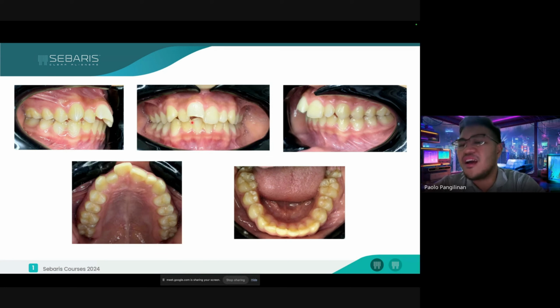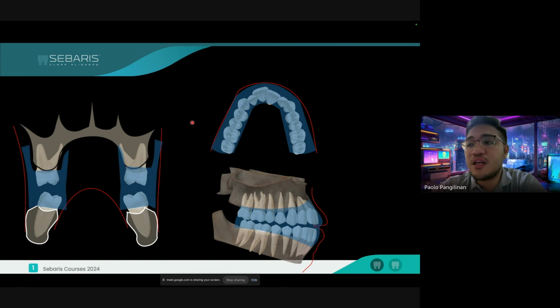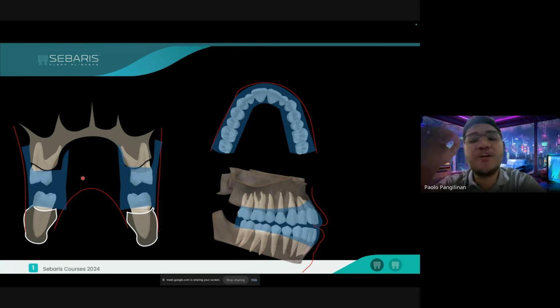So what did I do here? I still wanted to do expansion. Yes, I can use clear aligners, but my problem is caused by soft tissue pressure from my cheeks, lips, and tongue. So instead of using aligners, I used another appliance called myofunctional appliances. What the myofunctional appliances do is train the muscles, your lips, your cheeks, and your tongue. They tend to control them. Once those muscles are in equilibrium, where will the teeth go? So basically, your muscle trainer allows arch development.